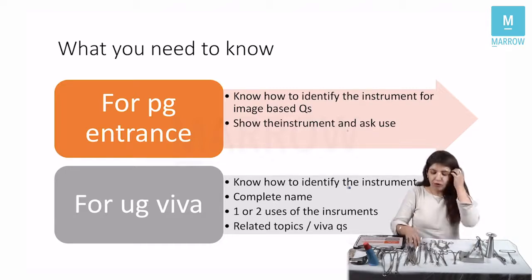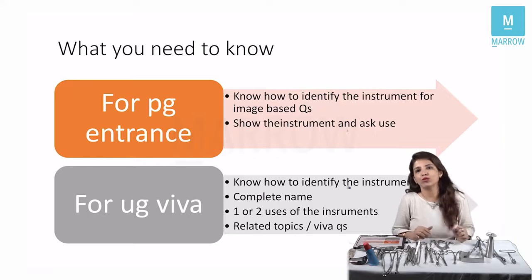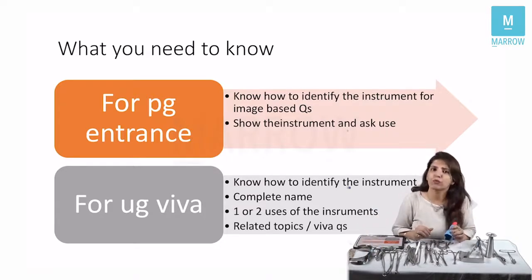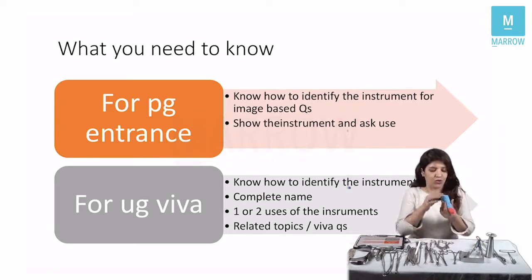right? Before I start telling you what are the instruments which are used for examining the vagina, cervix, etc., I want to talk to you a little bit about the anatomy of the vagina and the anatomy of the cervix. So I have tried to recreate a model of cervix and vagina here.